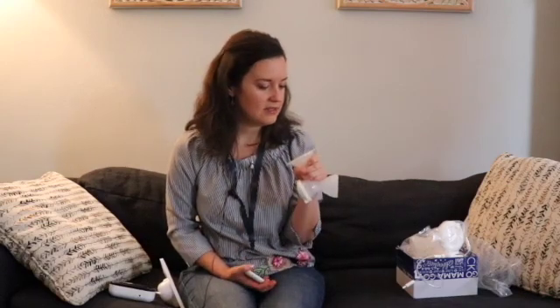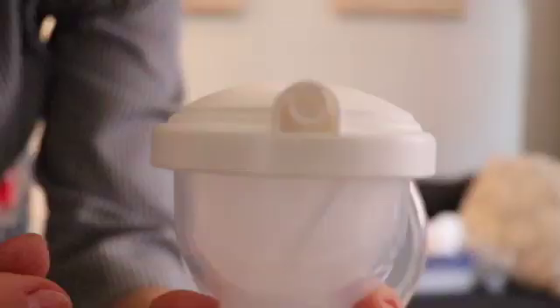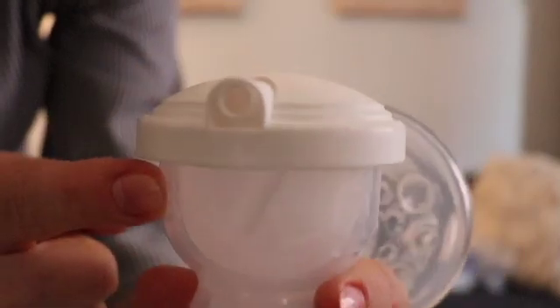The only thing to note so far for me is that it only comes with one flange size, the 24 millimeter. And on the upside, it has this soft cushion, which can help for people who might need a smaller size. But if you need a larger size than a 24 millimeter, if you've used another pump in the past and you know that you need like a 28 or 30 and up, you would want to order that ahead of time.